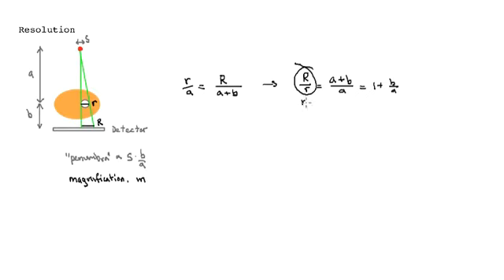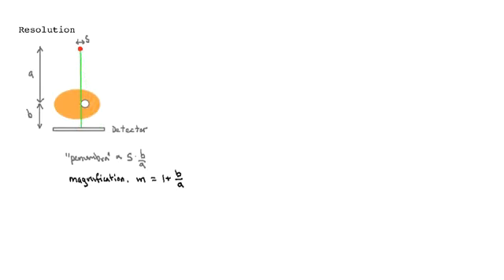And this thing here is called the magnification, or mag. So let me rewrite it down here. So you'll see that mathematically and geometrically, these quantities are related to each other. So let's look at how this plays out in an example. Let's move the patient a little bit. We moved them up towards the source.